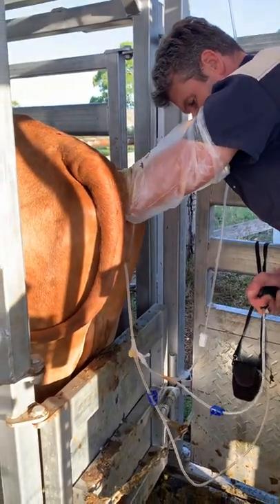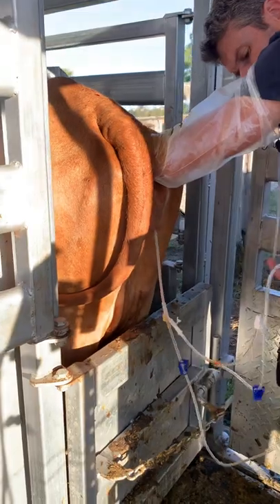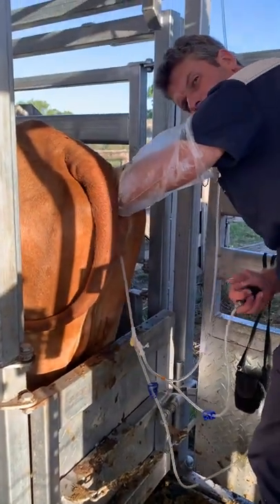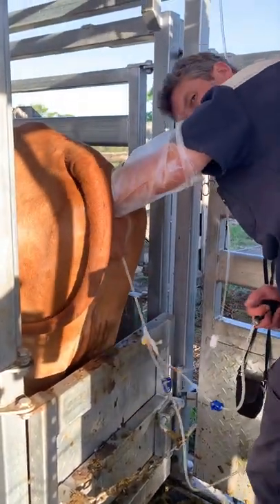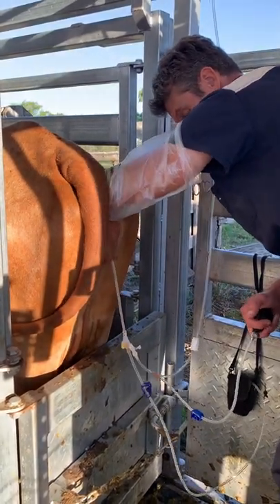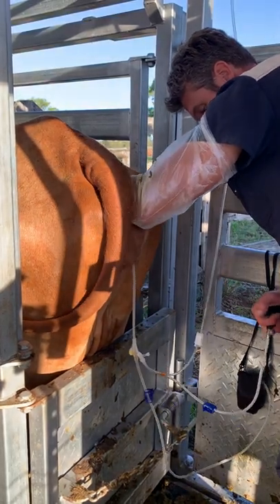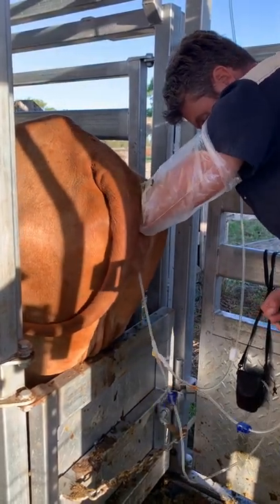So that's air pushing in and I've got the uterus lifted up a bit now, and I will twist it and turn it a little bit while I'm doing the air so that I know I've got all the fluid coming out. I'm just wiggling it around now to make sure all the fluid comes out. Alright, that's air done.